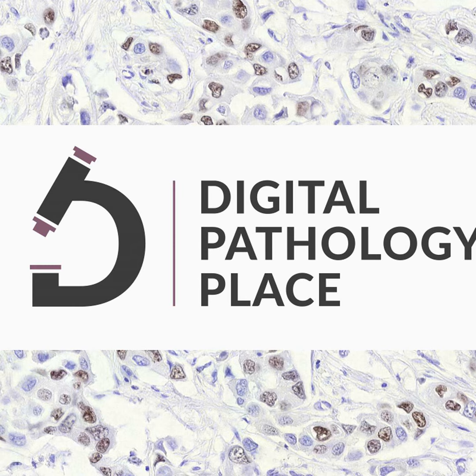Telepathology. The term telepathology is a portmanteau of telecommunications and pathology, signifying the use of telecommunications technology to facilitate the transfer of pathology image-rich data for diagnosis, education, and research. The seeds of this remarkable technology were sown in the late 20th century, in an era where the concept of transmitting medical images over long distances was a novelty.